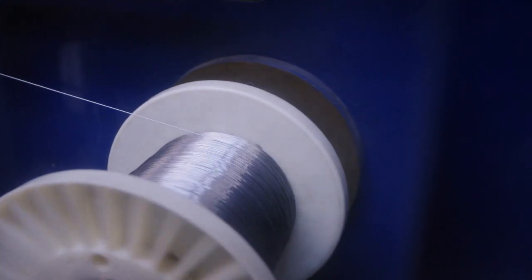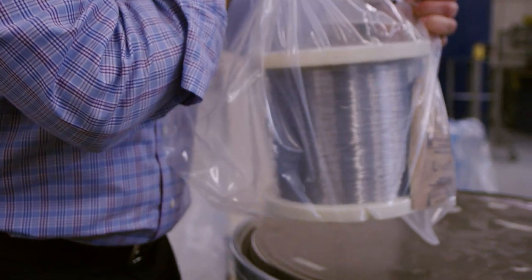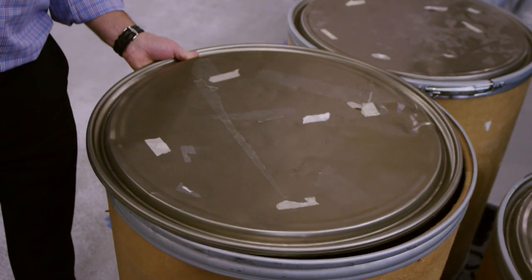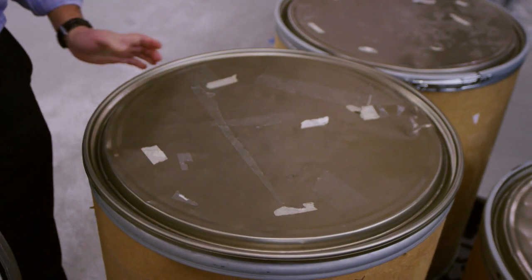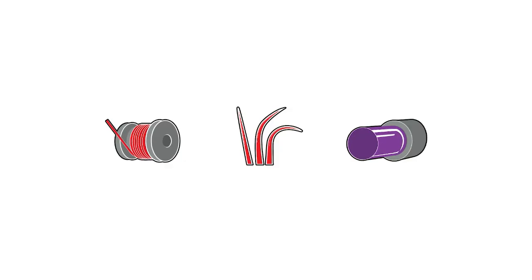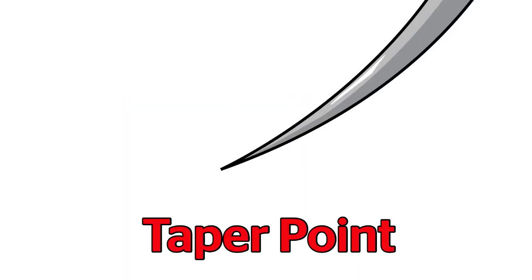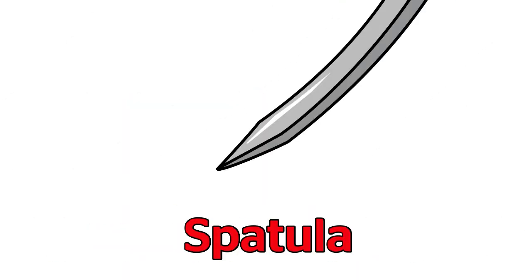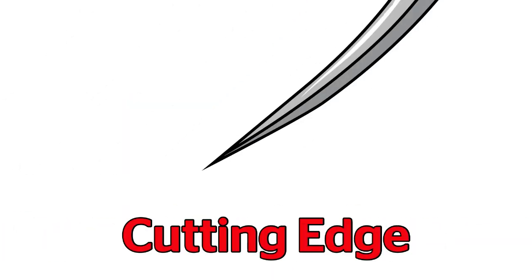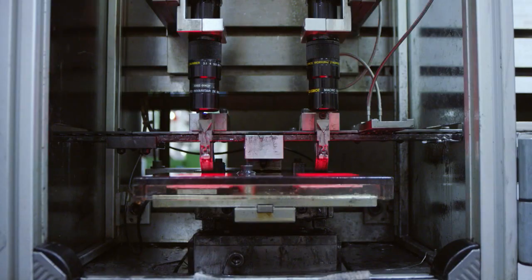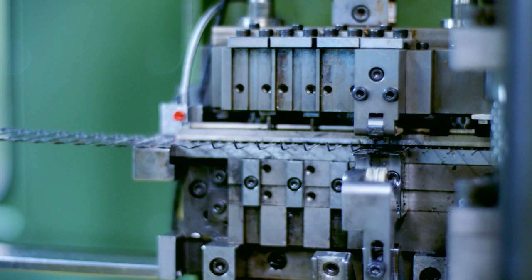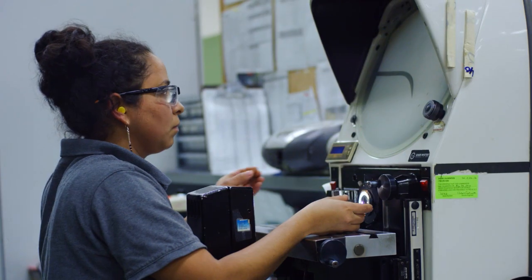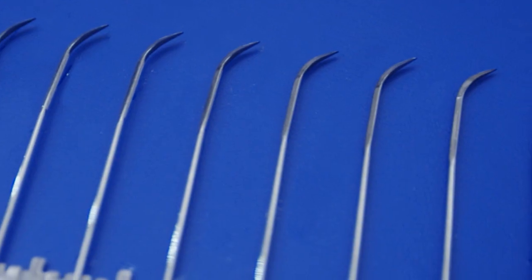Now we're down to the wire as the process spools are shipped to Ethicon's needle making facilities around the world. Taper point, spatula, blunt point, cutting edge—what's on your suture? Through coining, grinding, curving, and testing, Ethicon produces a wide range of needle geometries.